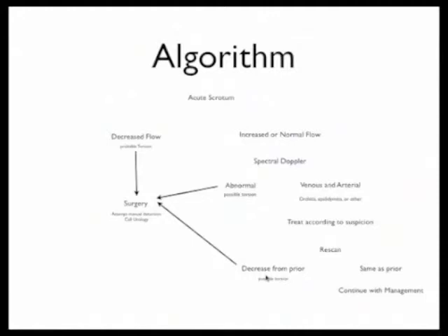However, if the testicle looks the same still after treating them, they're feeling better, their pain's not going up, you scan them again and it's not decreased more from prior, maybe it was just really early and they had a venous waveform. I don't know if that exists or not. I don't know if you can have pain and still have your venous waveform on spectral. But there's another reason to rescan them, to see if anything's changed. And if it's totally the same and you still think it's orchitis or epididymitis, then I at least have sent these patients home in this case. And I felt comfortable doing this.